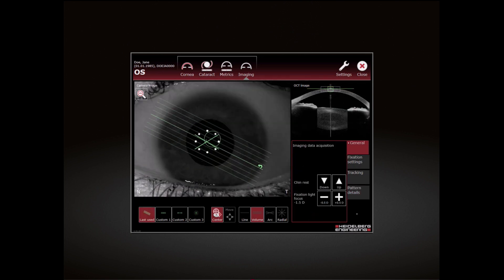After the first image acquisition of the current session, the Last Used button is available to reuse the last scan pattern.